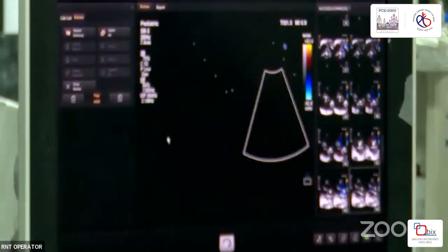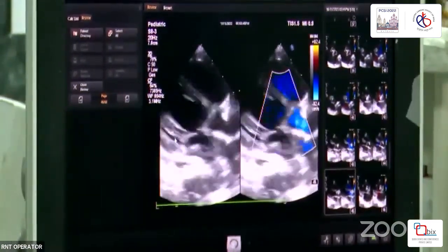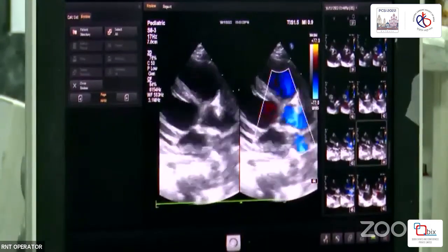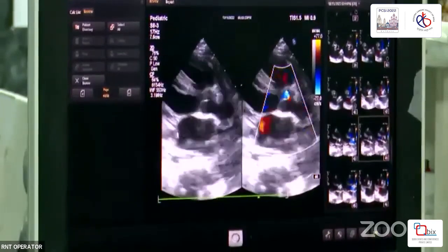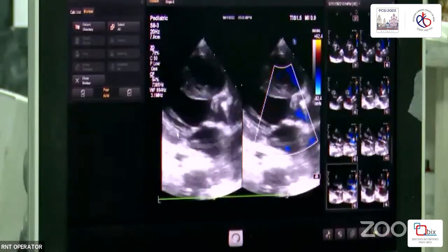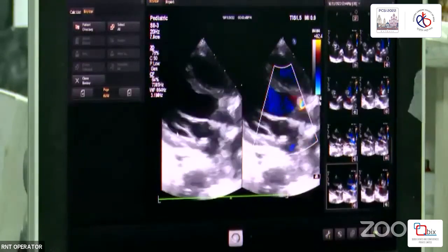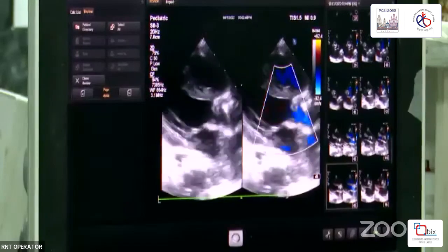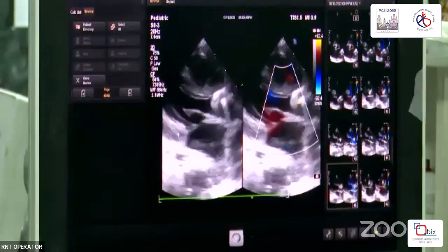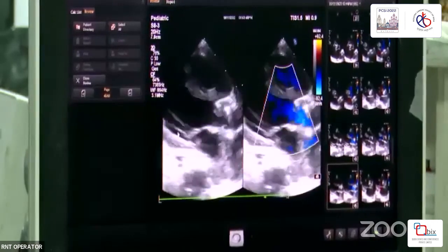So what is that underneath the right coronary cusp, the red flow there? This is actually pre-release, the cable is still attached to the device. Definitely a neo-aortic regurgitation. You may accept it, but there is a neo-aortic regurgitation. Now since the cable is removed, can you show us the live echo?